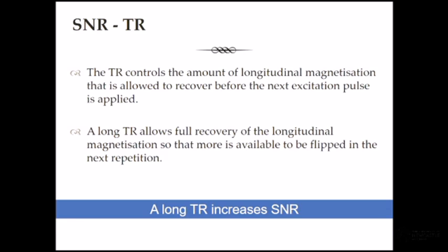Okay, so that's all that's saying, and that feeds into this idea of saturation effects, and also feeds into one of the questions that we covered, which was about T1 relaxation time increasing with increased magnetic field strength. If you change your magnet from a 1.5 Tesla to a 3 Tesla, and you want to just import your scanning protocols, there's a few tweaks you have to make around that TR time, because the T1 relaxation time, the amount of time it takes to realign, increases with increased magnetic field strength.